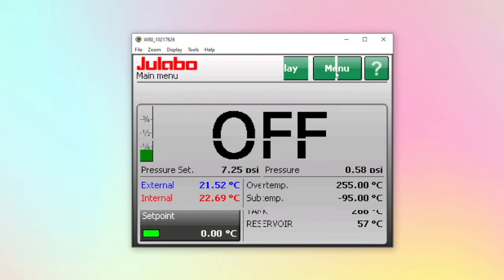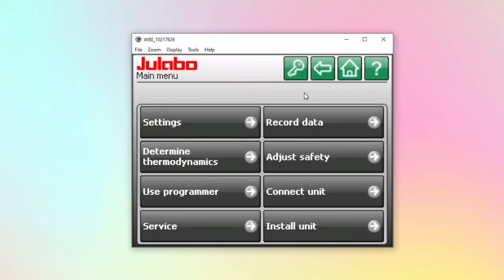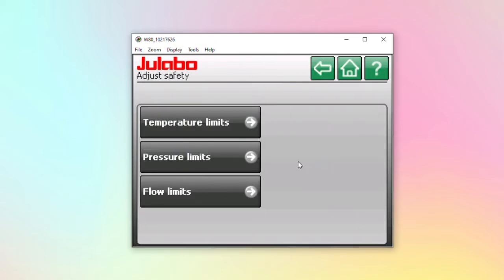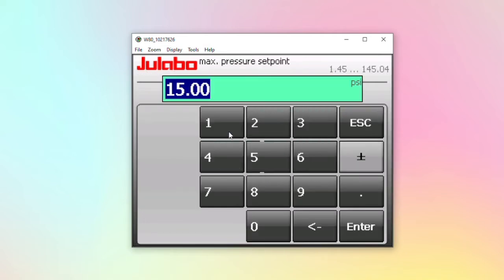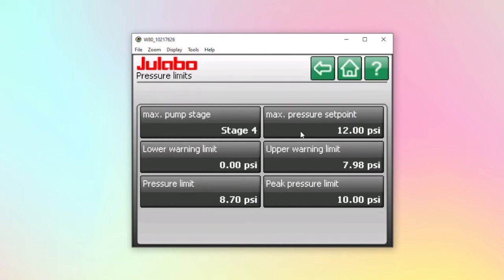So you can access all of the menus. Say we want to adjust the safety — we can go into Pressure Limits. And now we've changed the Max Pressure Setpoint, which will appear on the Presto as well.